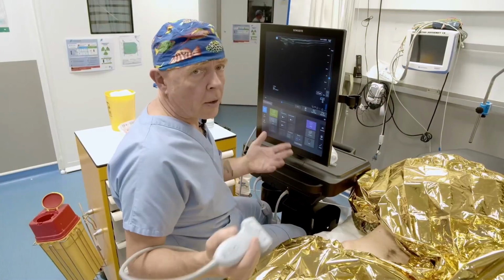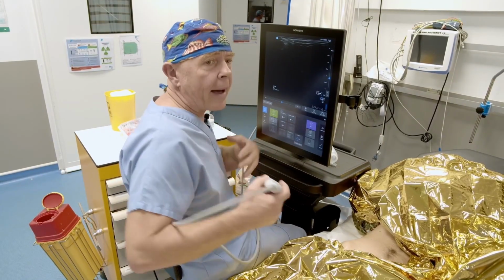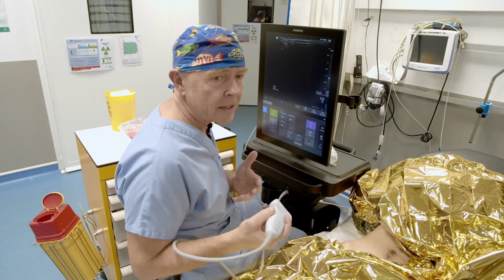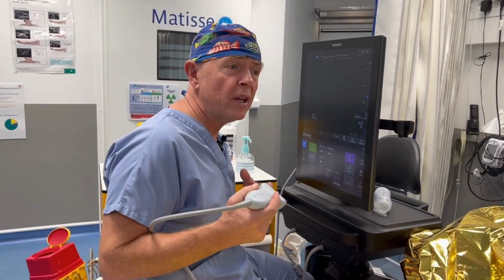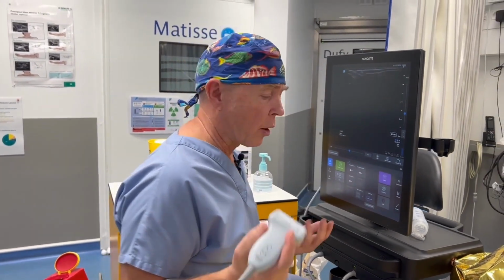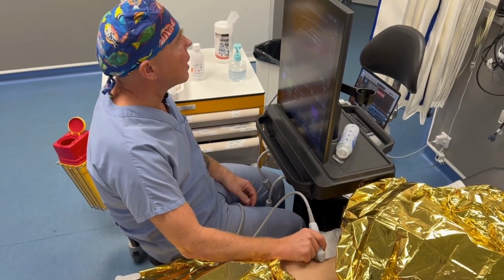Regional anesthesia. So the TAP block, so that's one of the blocks that is both the easiest to identify because the Sono-Anatomy is really very simple and well known, and to achieve maximum clinical effectiveness, which in my opinion is actually quite complicated, because the effectiveness of your block really depends on where you position your probe. So the classic description is this: you place the probe here like this, and then you get the image.